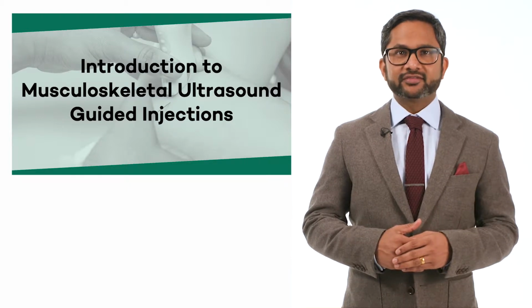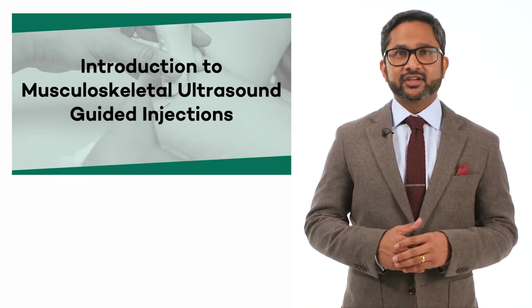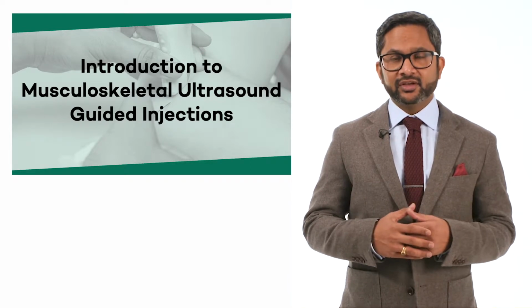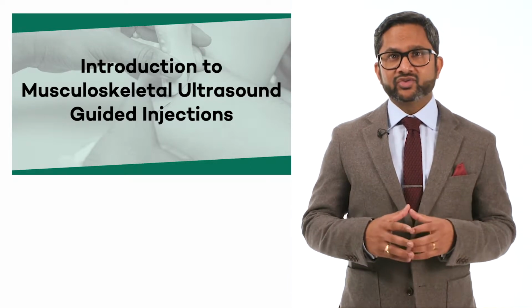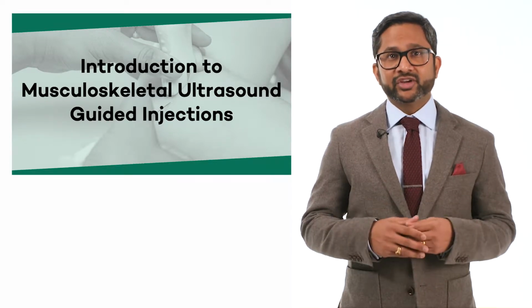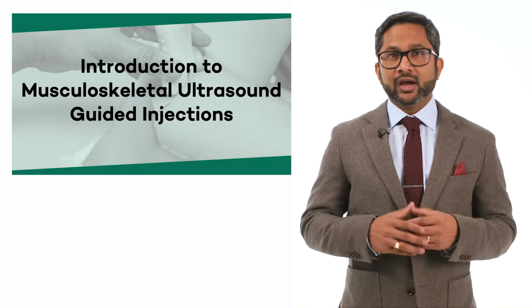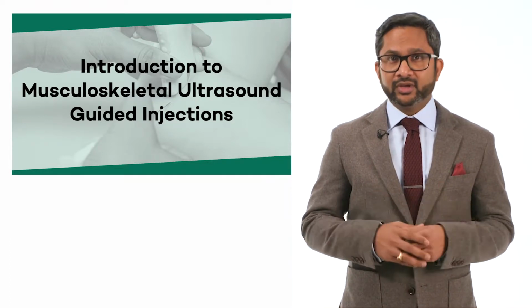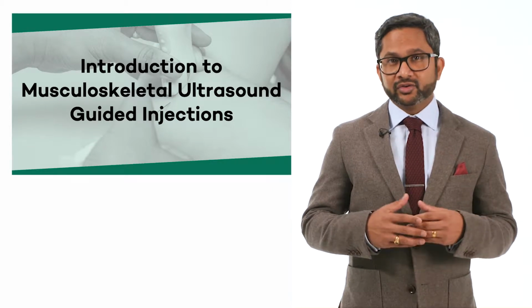Use of ultrasound has expanded significantly in the musculoskeletal field in recent years for several reasons, including improved safety, portability, decreased cost, lack of ionizing radiation, and increased educational opportunities. Ultrasound can be used for diagnostic, prognostic, evaluative, rehabilitative, and interventional purposes.